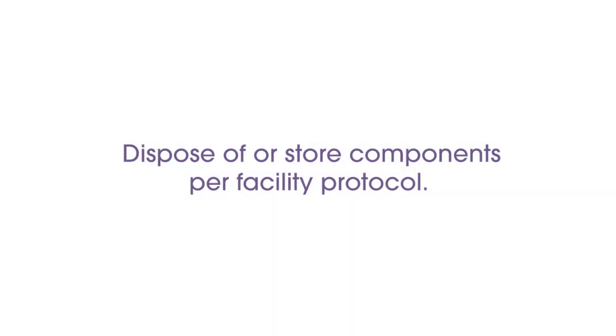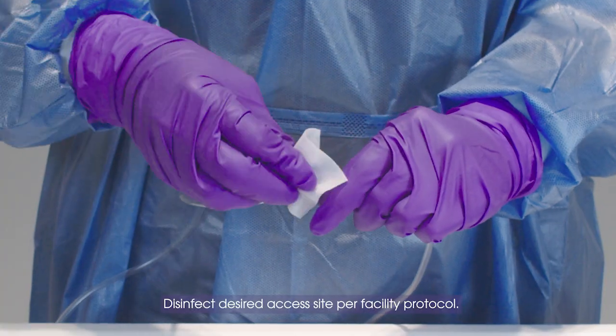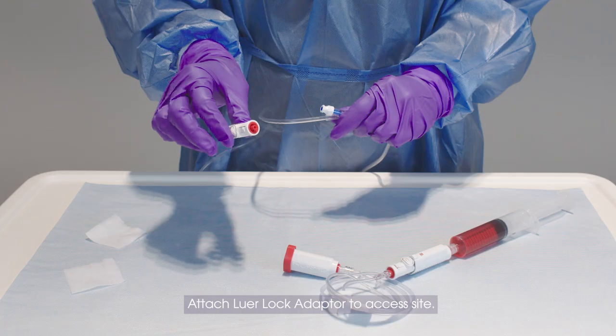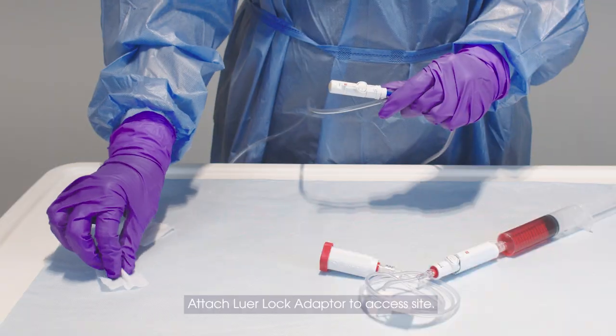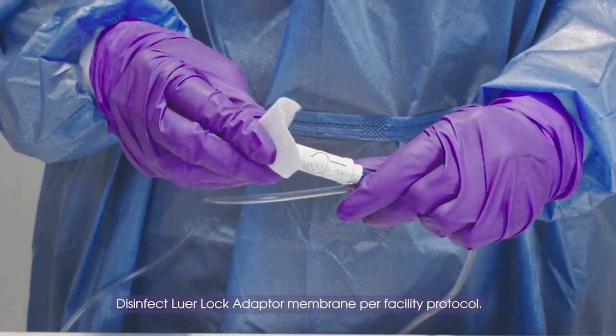Dispose of or store components per facility protocol. Disinfect desired access site per facility protocol. Attach lure lock adapter to access site. Disinfect lure lock adapter membrane per facility protocol.